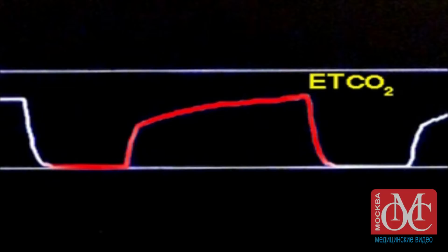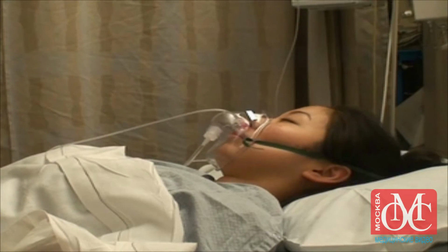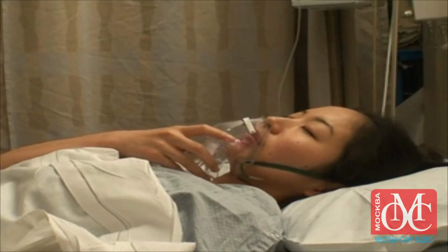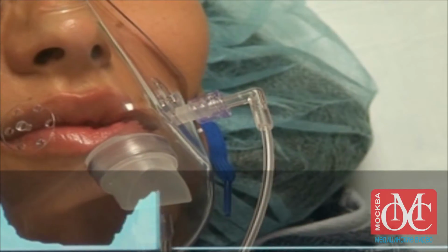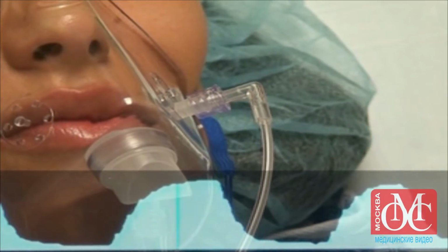In patients who are not intubated, the samples of the exhaled gas are mixed with the surrounding atmosphere and fresh gas flow, diluting the concentration of carbon dioxide. As the sidestream catheter is moved farther away from the patient's airway, the EtCO2 value will decrease progressively. Although the EtCO2 of a patient who is not intubated represents only a qualitative indicator of ventilatory status, the patient's respiratory rate can still be determined from the waveform of the capnogram.